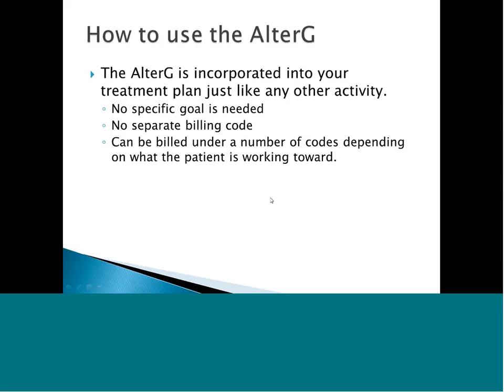For example, standing in there doing static standing but doing knee flexion in there, as opposed to active assisted range of motion. You take some weight off. It's similar to what active assisted range of motion is going to be, but they can do it completely on their own. And the fact that they can see themselves lifting their leg like that on their own with no assist, it really does work wonders for their confidence.